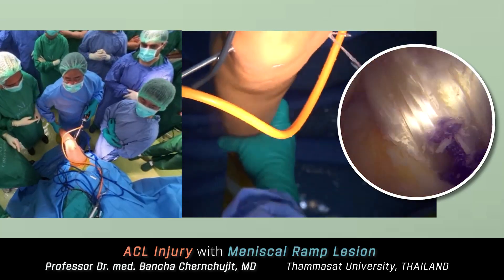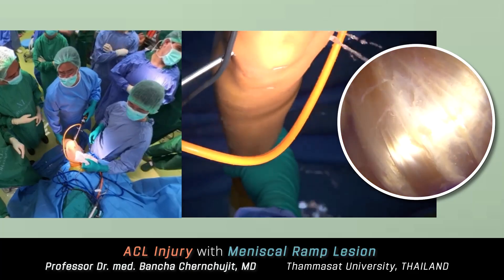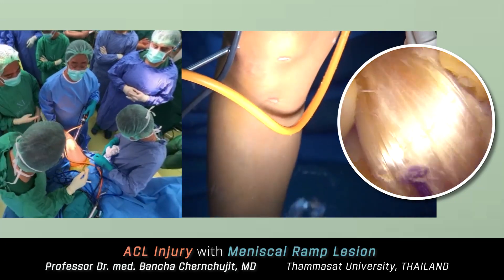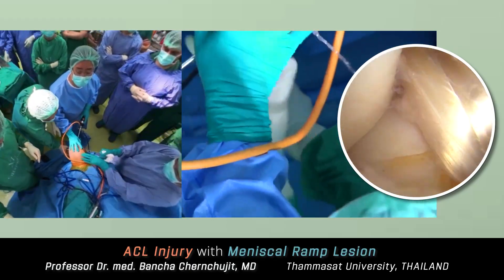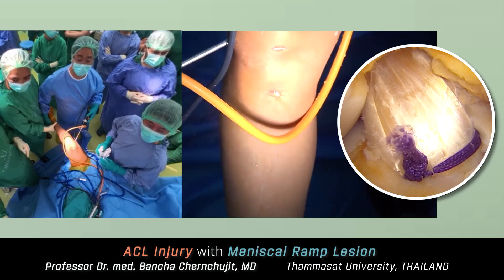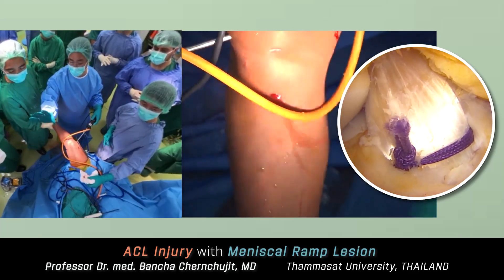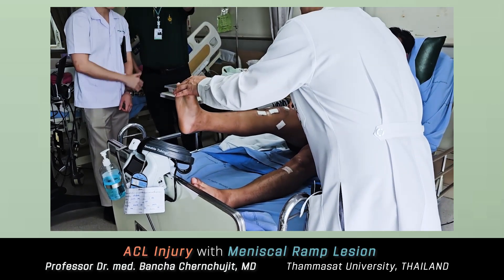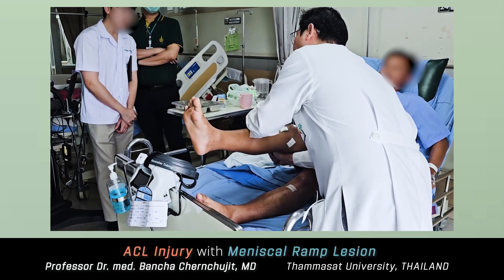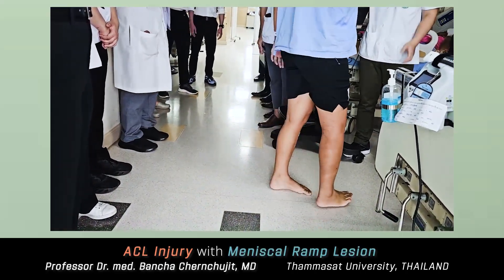The ACL graft has a shiny, smooth appearance with no impingement on full extension, even at 11 millimeters in diameter. Using a button for tibial fixation allows me to retention the graft after pretensioning at 90 degrees of flexion, tightening each bundle under good tension — a problem that cannot be solved with a screw alone. Ensure the graft has no lateral wall impingement, no notch impingement, and no impingement with the PCL. Overprotection is not good for rehabilitation — it leads to muscle atrophy. Even after harvesting the rectus femoris, patients still have good quadriceps function, and in a healthy muscular patient like this, I let them walk right away with no protection for faster recovery.